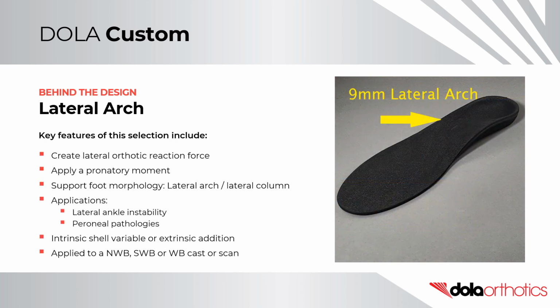Key features of this selection include its use to create a lateral orthotic reaction force or apply a pronatory moment. It can be used to support foot morphology, including the lateral arch or lateral column. Other applications include for lateral ankle instability or peroneal pathologies.